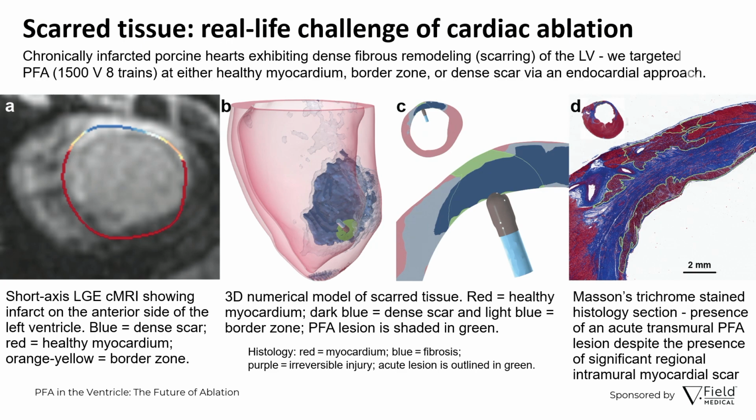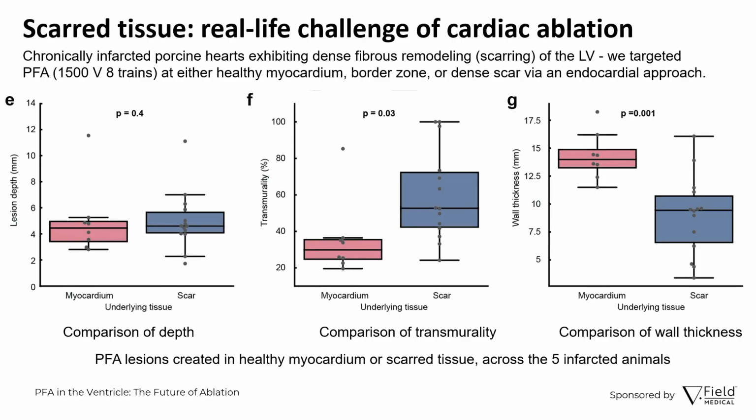It tells us that the scar, because of the myocardial infarction, does not really represent such a terrible barrier for the ablation. So scar homogenization is maybe achievable with PFA more than with thermal energies. And with this, of course, the light part of the evening is over. Thank you. This is the data, and we can't forget this.